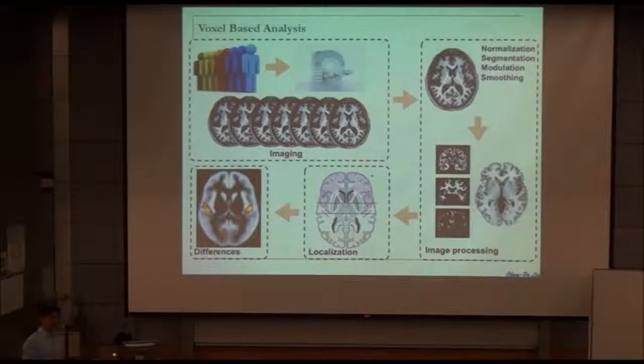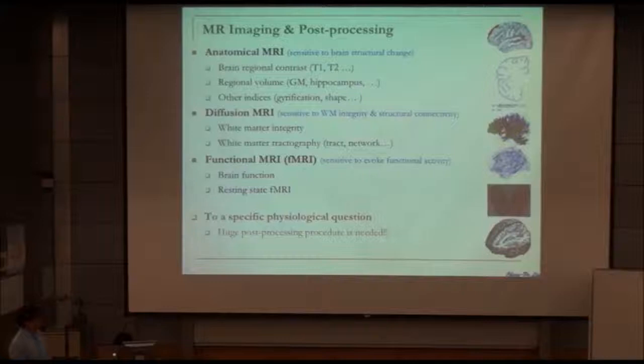So you can see that nowadays, for such brain studies, we not only need to acquire good images, but also need very good post-processing techniques. In this way, you can identify very important information within these two groups. So I want to emphasize that.